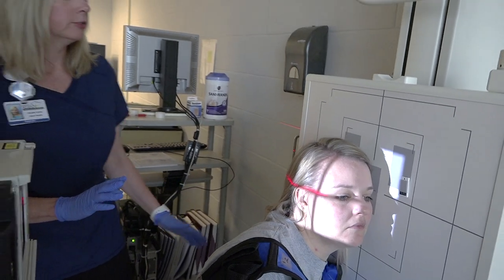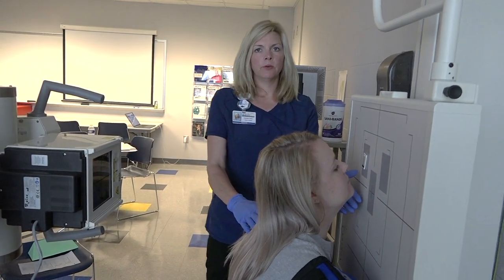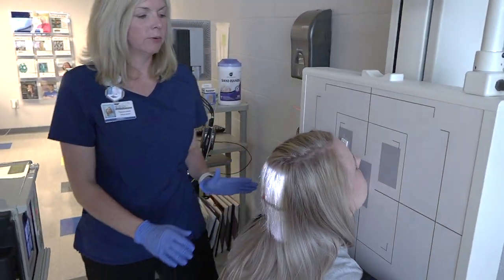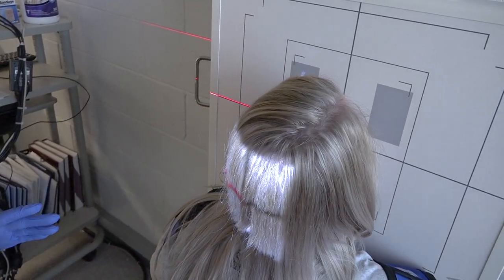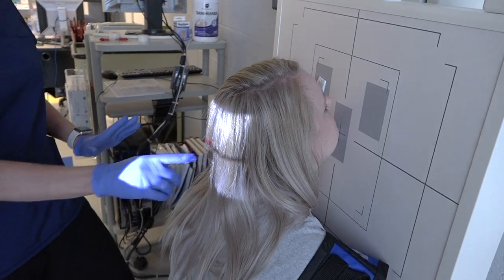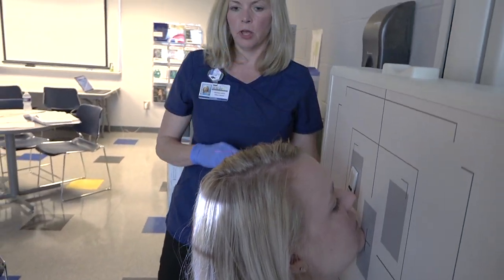Now we'll go to the Waters, if you'll face the board. And if you'll lift your chin up. An easy way to remember the Waters is you're lifting your chin above water. So your mentum is in the middle of the bucky. It's in the center. You want to make sure, so I'm going to move you over just a tad, make sure there's no rotation or tilt, and your central ray is down the mid-sagittal plane. But the centering for the Waters is at the acanthion, so that's right under the nose.